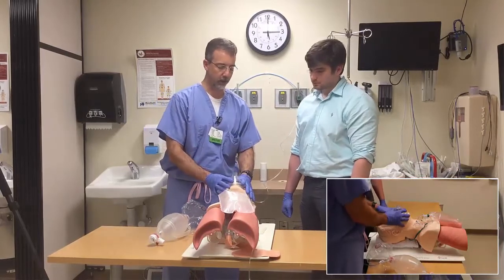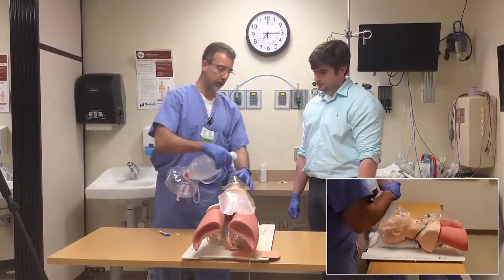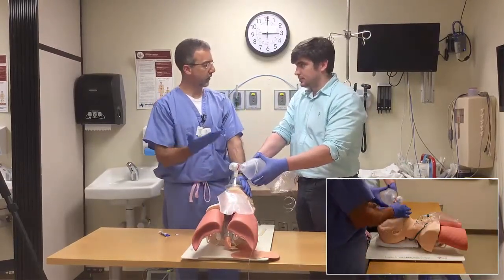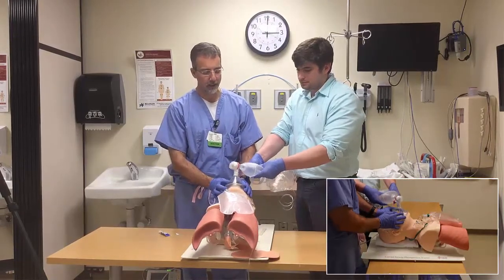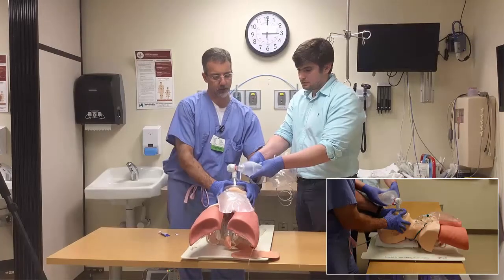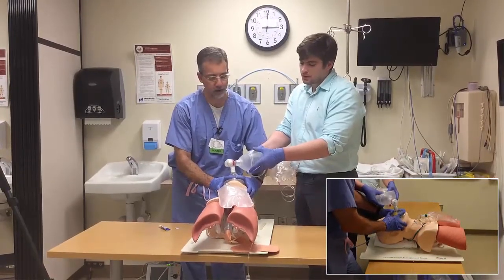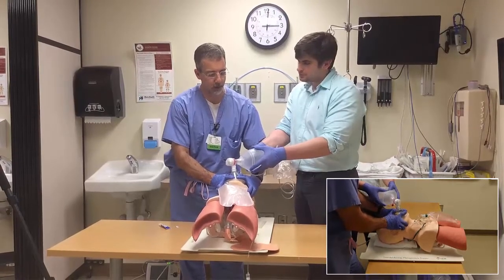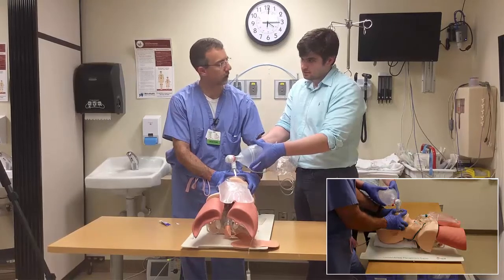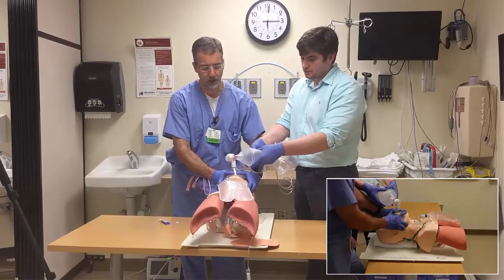The best way to do this is a two-person technique. We've sized the mask appropriately, and a two-handed technique to create the seal gives the best result. Put your two thumbs up here, two fingers down here, creating a C-E technique. Take two fingers on each side just like with the jaw thrust, pull up into the mask, and pull fingers down into the face. Now I've created a seal — you can see chest rise, and that's the true measure of whether this is working. You want to see chest rise, hear breath sounds, and hopefully see improvement in oxygenation and ventilation measurements.